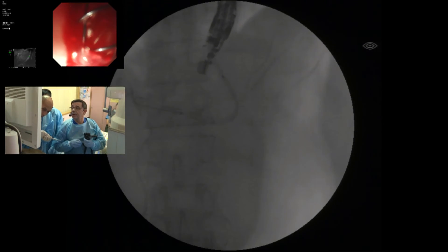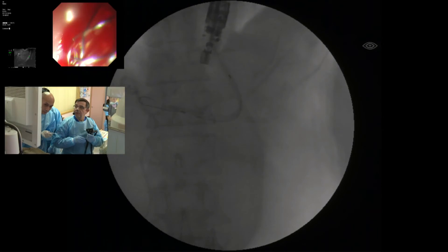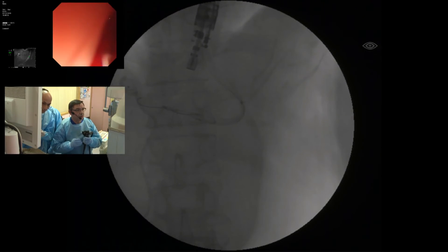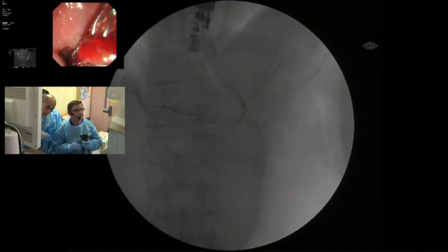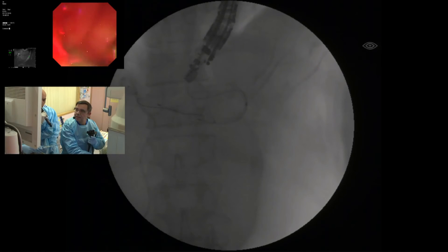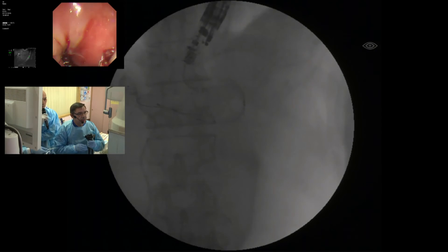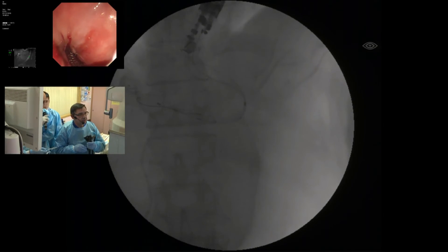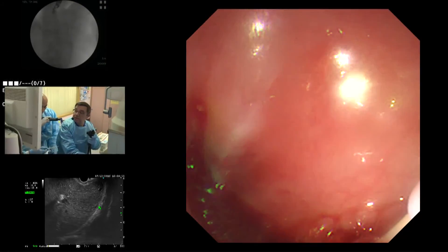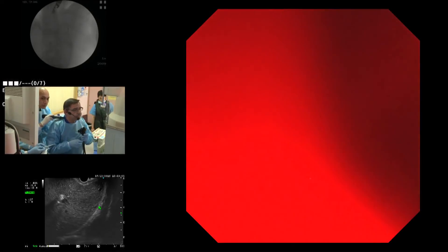Fully deploy — you can deploy. It's fully deployed. I will remove — the stent is probably okay. Now it's deployed — it's in the stomach. You're going to push back into the stomach; it's just at the junction. Now I will push the stent into the stomach. I will leave in place a nasobiliary drain — no, I think it's okay. The stent is just in the stomach.